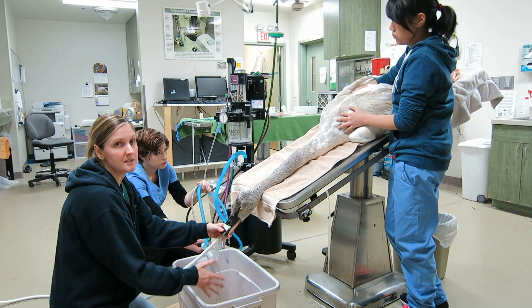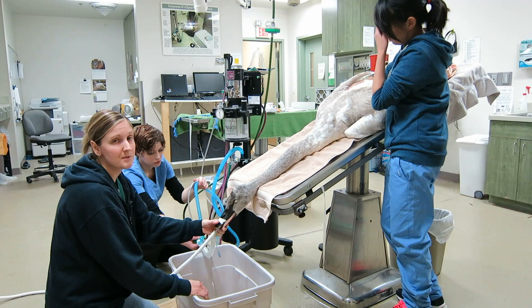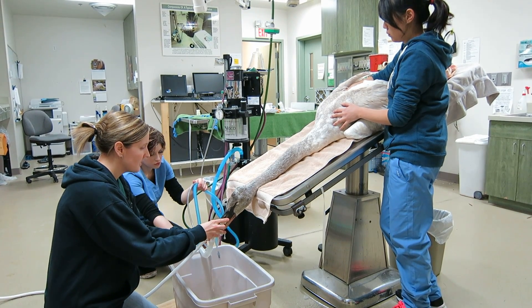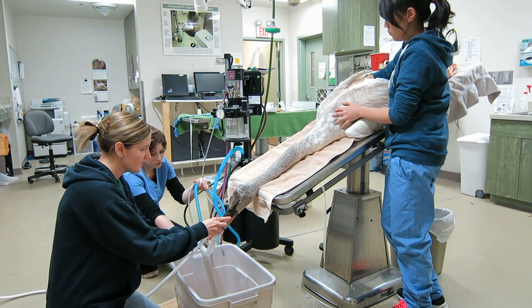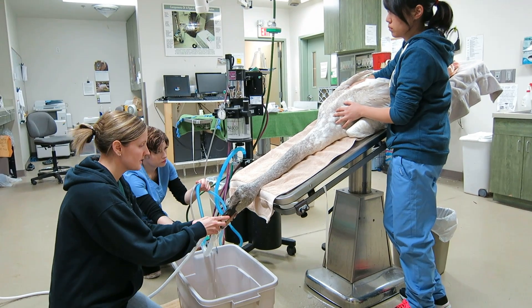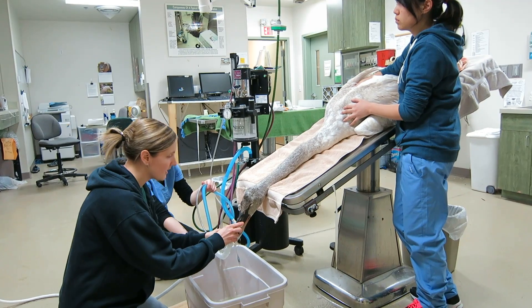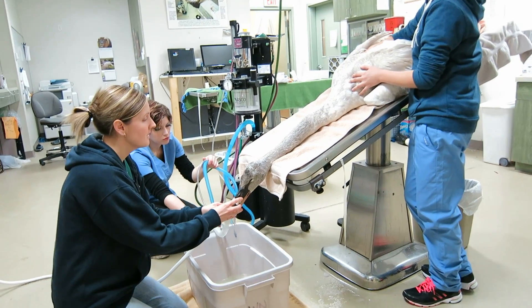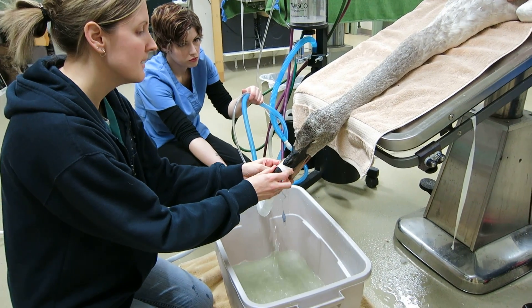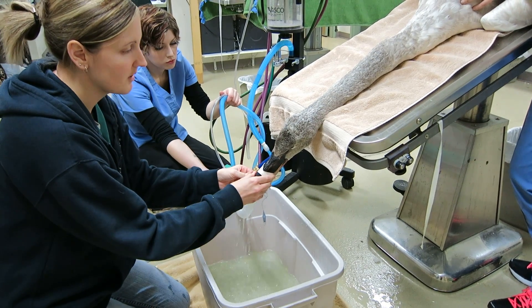Anesthesia also depresses their respiratory system and heart rate, so we try to get them flushed as quickly as we can. What I'm going to do is pull this tube in and out — that's going to push some of the material in the stomach around. Sometimes the tube can get caught up in there. We've got some pieces coming out here; whether it's lead or not I don't know yet, because swans also have pebbles and rocks in their stomach which can look very similar to lead.